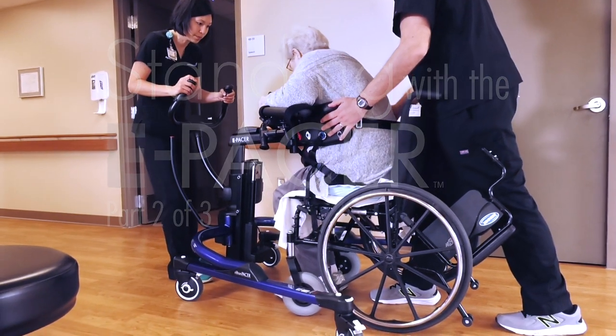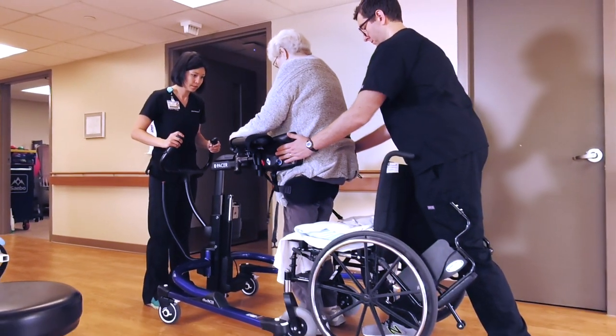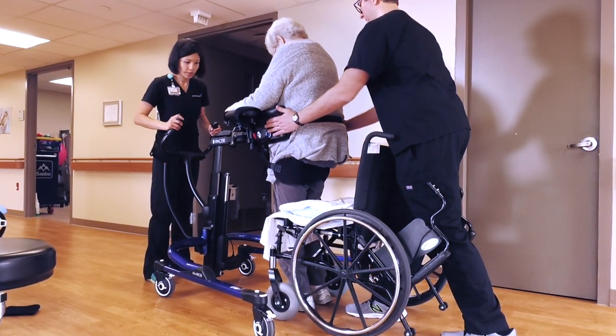For patients with poor sitting balance who cannot safely stand, initial sessions will focus mainly on standing and posture, with two people assisting.